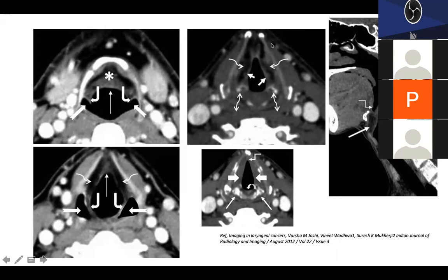So this cartilage is not ossified. When it ossifies, both the cortices, outer and inner, and the medulla get filled with fat. So there is a decent contrast, and you can comment much more confidently if there is any erosion. But the problem happens when there is no significant ossification, and this is unossified. Then it becomes problematic, especially evaluating it with the CT scan.